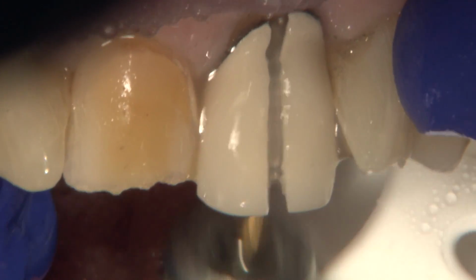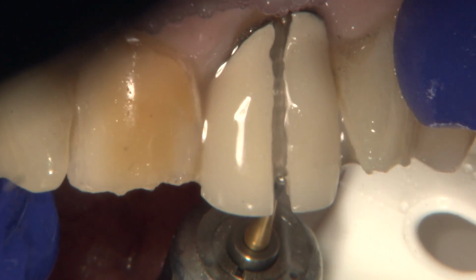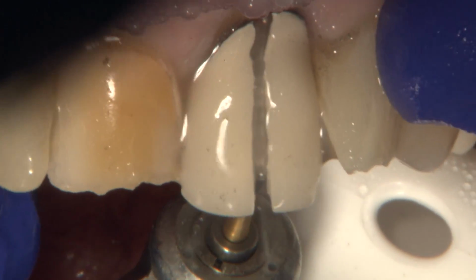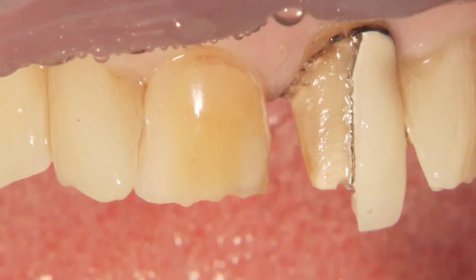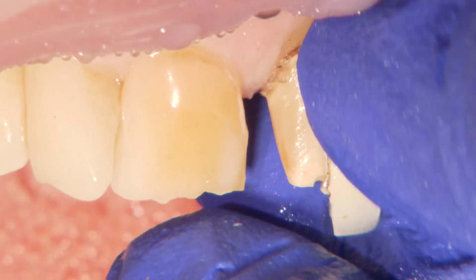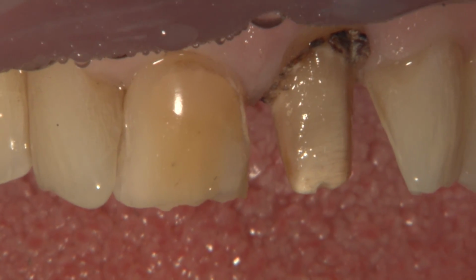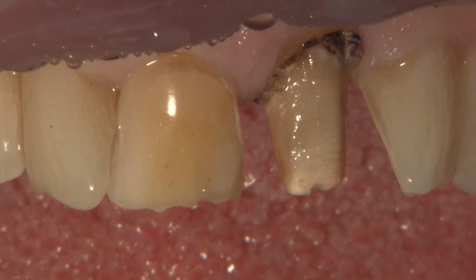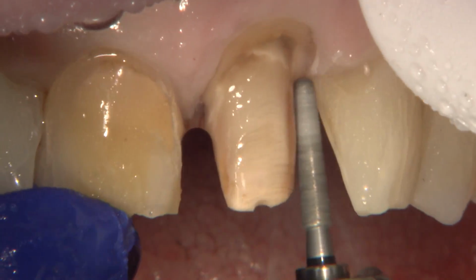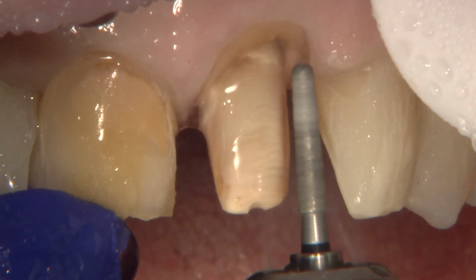Next comes the removal of the 46-year-old PFM on number 9, following a similar removal procedure with the razor carbide, easily cutting through both the porcelain and metal substructure. The original preparation was actually done really well, and it follows many of the modern-day guidelines for all ceramic preparations for reduction, taper, and internal roundness. I'm using a coarse round-ended tapered diamond to make some minor refinements and remove the remaining cement.